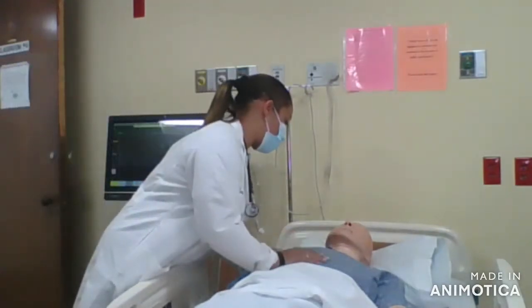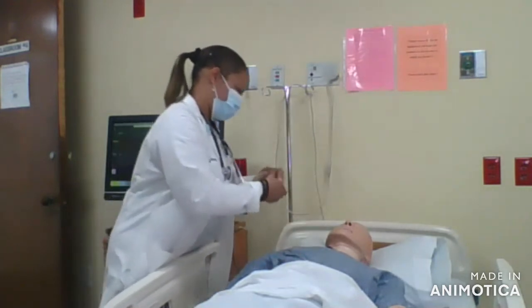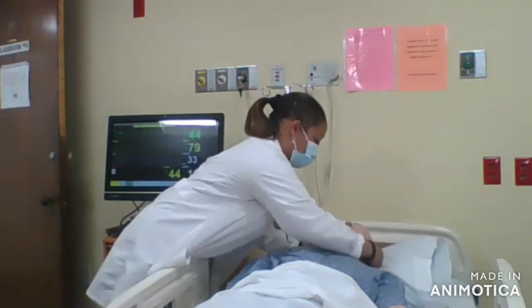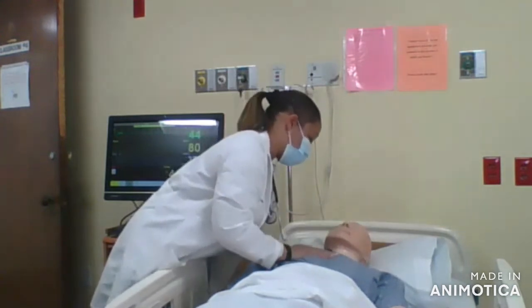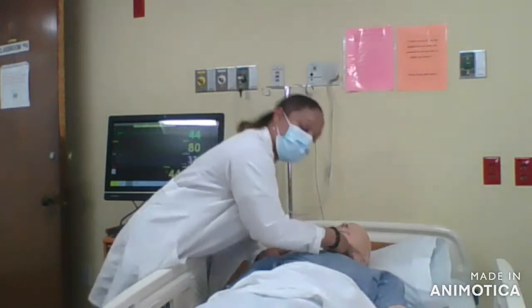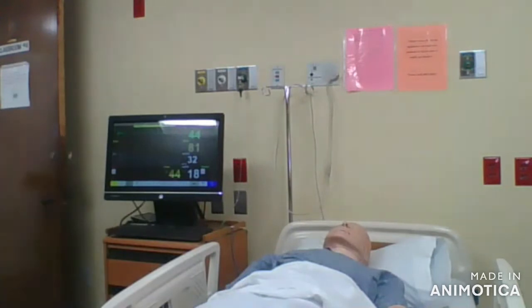Hi, Mr. Jones, are you okay? Your oxygen's a little low. Maybe you need some more oxygen. Mr. Jones? Mr. Jones, can you hear me? Mr. Jones? I need some help in here. Please call the critical response team.